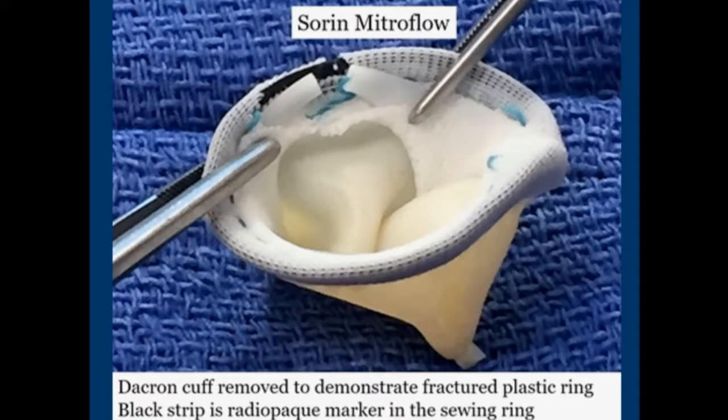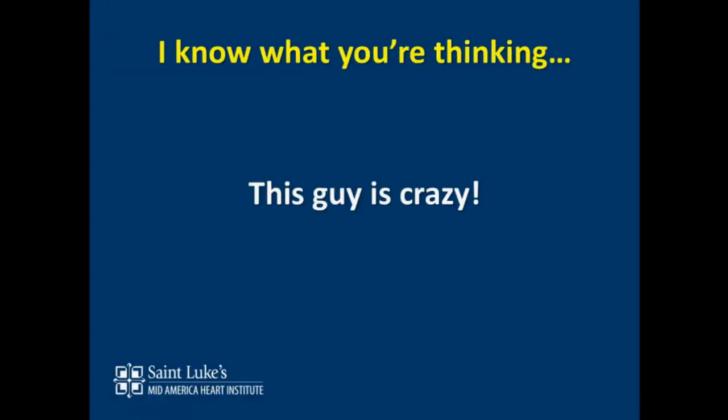The other comment that's very interesting is that this can be done also in the mitral position. And so we've done two patients in the mitral position for patient prosthetic mismatch. One of them, where the leaflets look normal, and we all looked at each other like we were going to get into big trouble when we did it, but the gradients did fall in half after we put it in. What size balloon would you use for a mitral? Had a 25 Mosaic. In a big guy. You use 28 True? A 25 Mosaic has a 21 internal diameter.